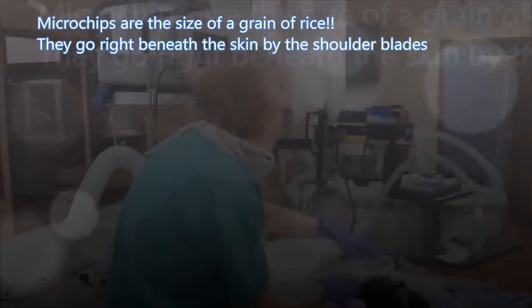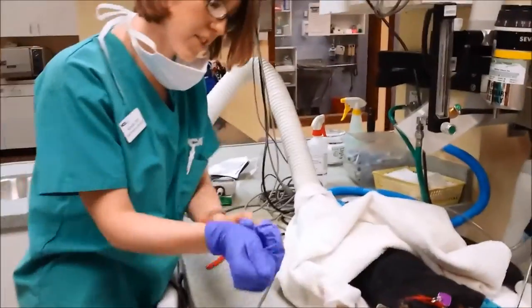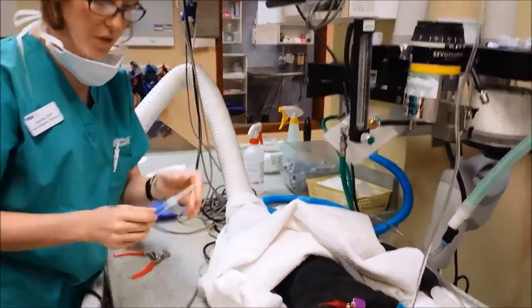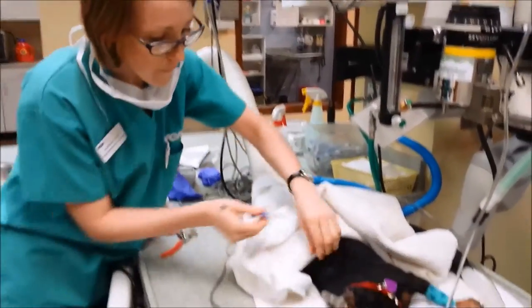We do this about at the shoulder blades and it goes right underneath the skin. Now we want to do this under anesthesia because we're not going to lie, it can be painful — but this way they don't feel any pain at all.